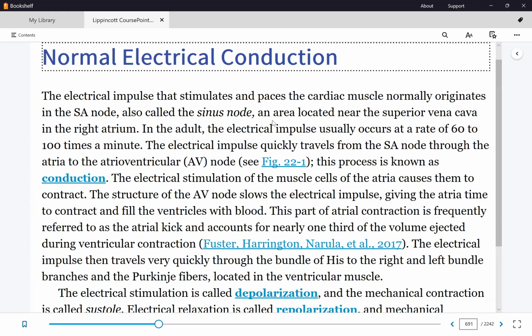Before we go to the abnormals, let's look at normal conduction first. So what are dysrhythmias? Of course, we have to look at the normal rhythm first. Each wave and complex here is an electrical representation of what's going on inside your heart. So we'll look at what a cardiac cycle electrical conduction looks like, and then we'll look at abnormalities or deviations from the norm. We have 3 pacemakers in our body.